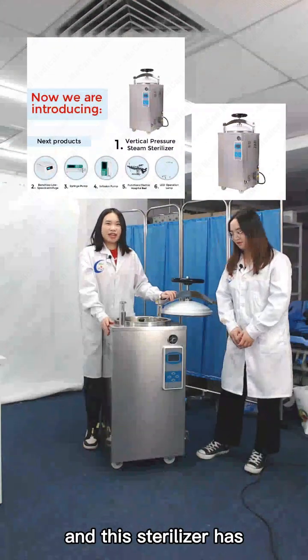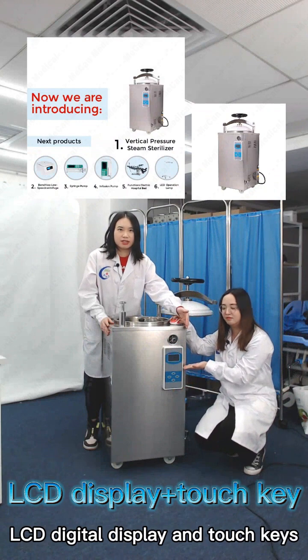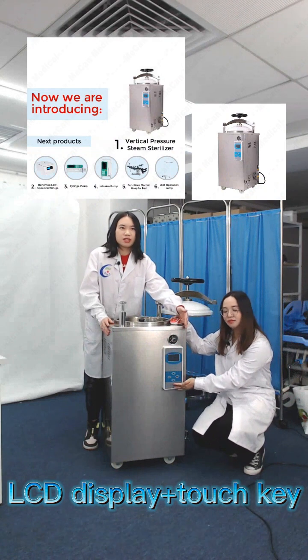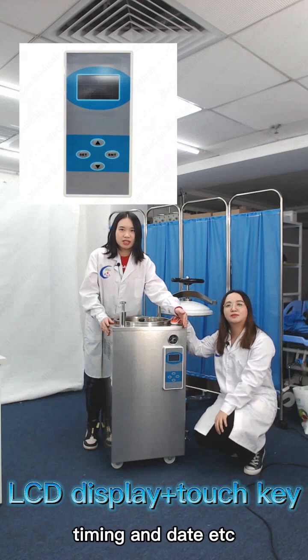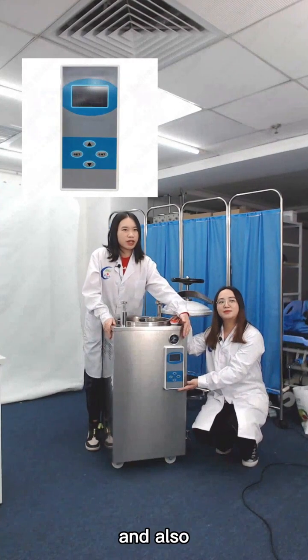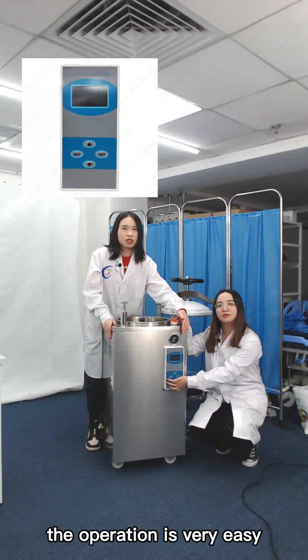This sterilizer has an LCD digital display and touch keys. The digital display shows the pressure, temperature, timing, date, etc. There are also keys to adjust the time and pressure — the operation is very easy.